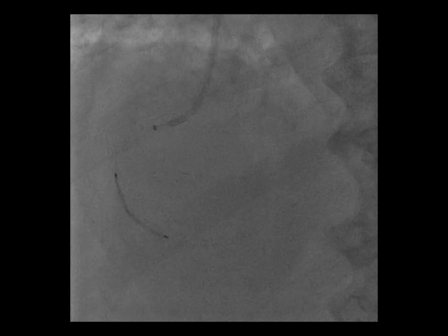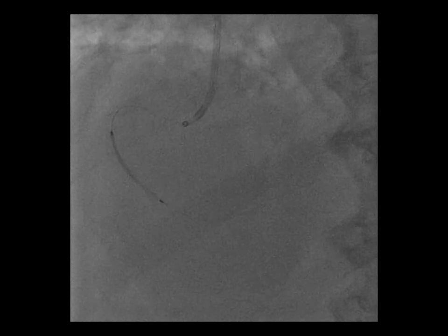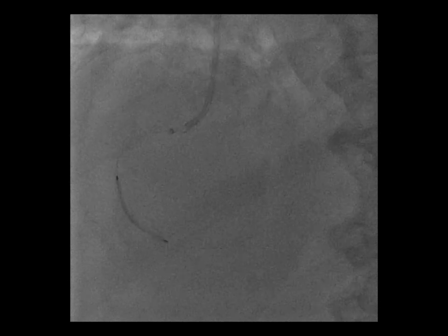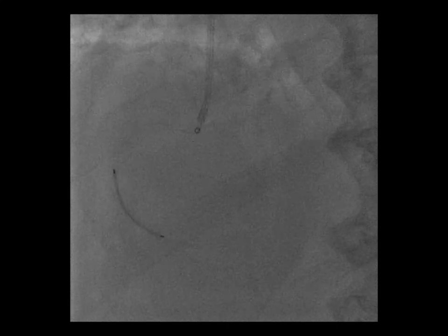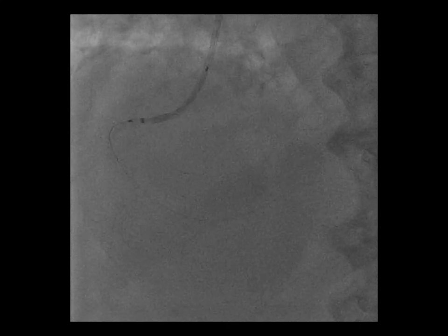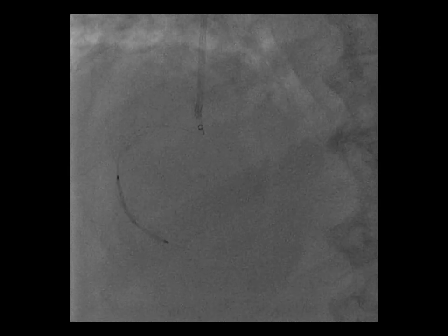We tried again with larger non-compliant balloon inflations at the lesion and proximally, but we were still unable to deliver the stent. So we used the guide catheter extension — we had the GuideLiner 6 French — and placed it in the proximal part of the right coronary artery and tried to deliver the stent. This time the stent could barely cross the proximal part of the lesion, but we were still unable to deliver the stent completely across the lesion with the GuideLiner in the proximal RCA.